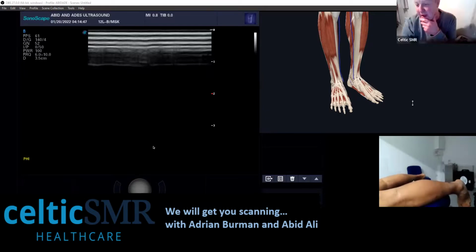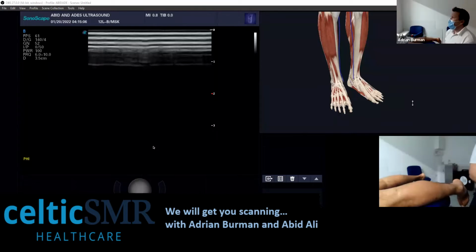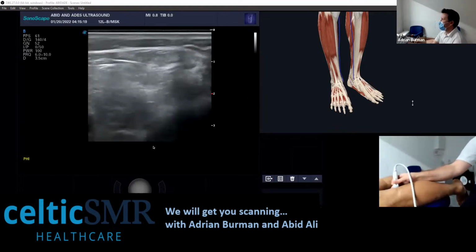So yeah, Greg actually wanted to see the popliteal fossa, so thank you, but also he adds, and any common pathologies. I think that's what you're asking, Greg. So any thoughts on that? Anything you might want to cover and ask? Well, the common pathologies would be the Baker's cyst. Don't see much else really. I mean, what else did you see?